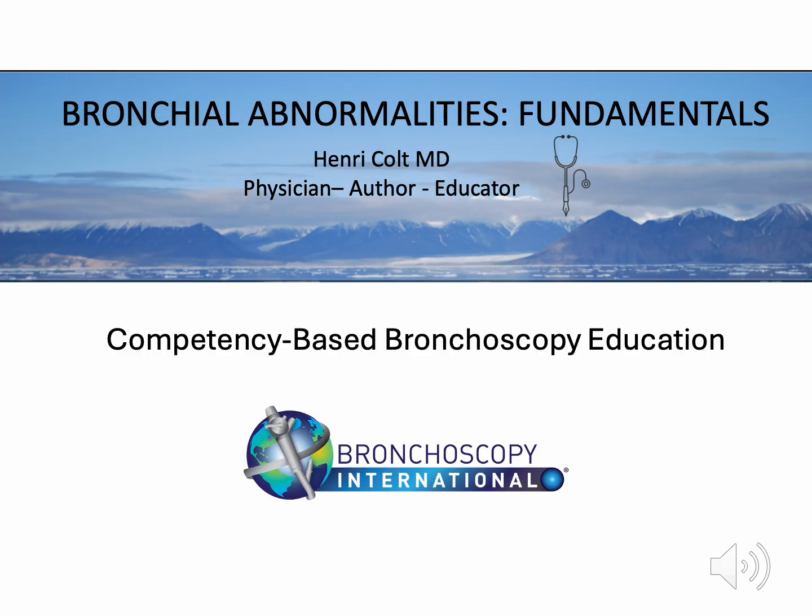In this lecture, we will review common bronchial abnormalities encountered during bronchoscopy. We will focus on systematic recognition of mucosal abnormalities, airway obstruction, bronchial strictures, anatomic variants, fistulas, and malignant lesions, while emphasizing the descriptive language required for accurate bronchoscopic reporting.